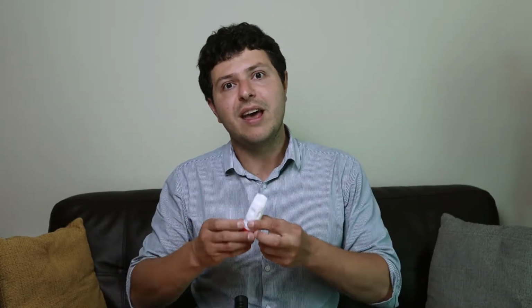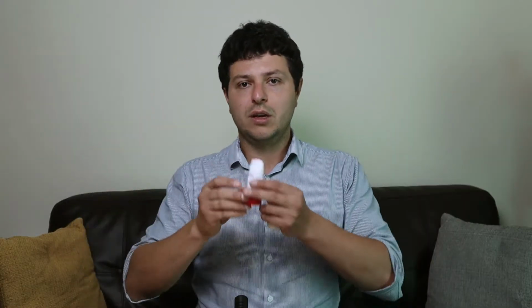So remember, for this one, I breathed in slow and deep. For this one, I'm going to breathe in powerfully and deeply. So I really want to get that powder moving, to get it deep inside my lungs. It's a heavier powder. It doesn't produce a puff that I just breathe in slowly, right? So for this one, I'm just going to demonstrate now. So it's armed, it's ready to go. So I'm just going to breathe it in.